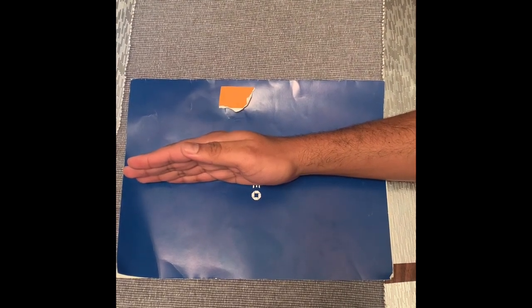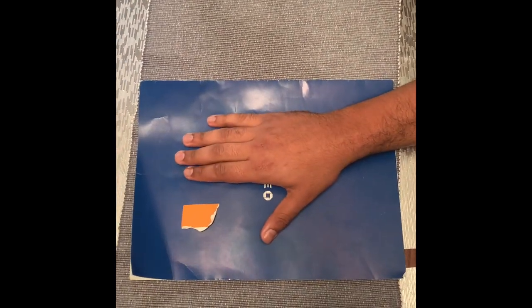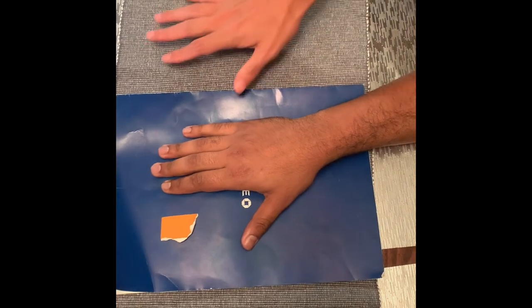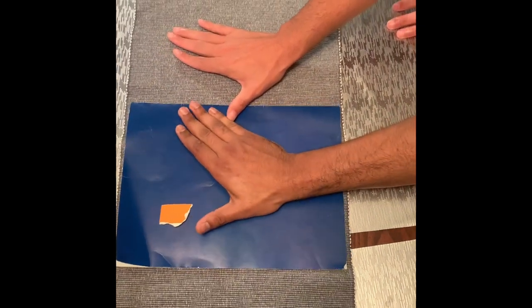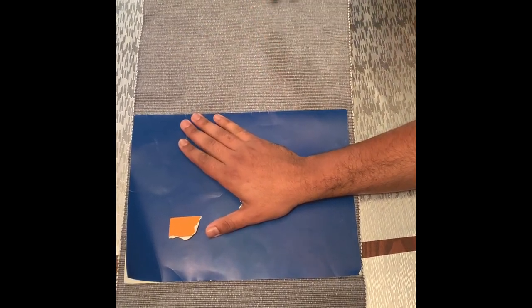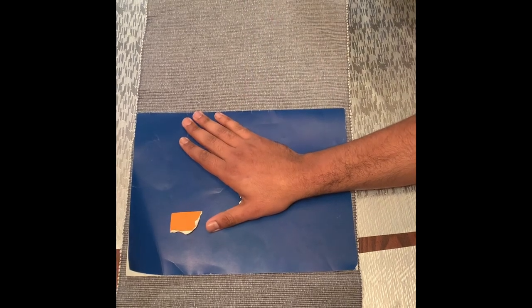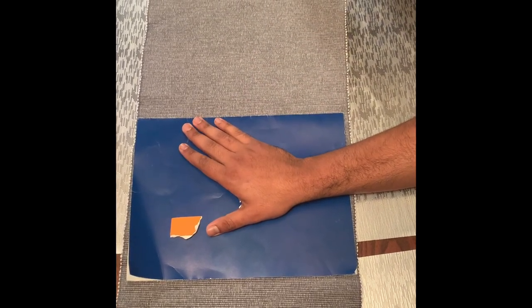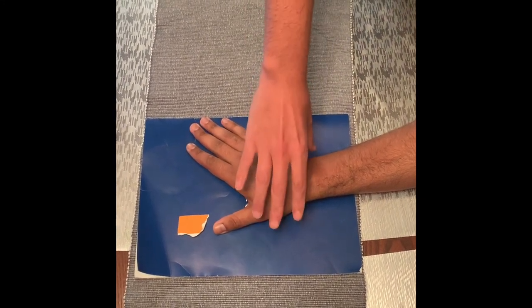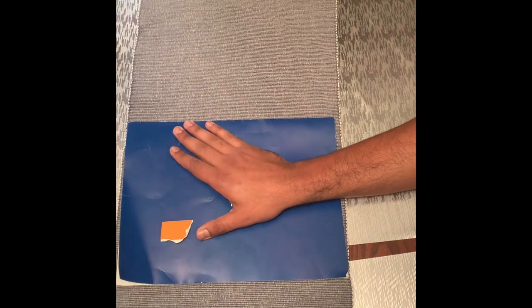For the next three views, the only change is going to be the cassette size, which is going to be 8 by 10. We're going to start with the wrist ulnar flexion. The patient places the hand in ulnar flexion. The central ray location is going to be directed perpendicular to the scaphoid. This procedure may also be done by using a 20-degree tube tilt. The anatomy demonstrated is going to be the scaphoid bone, free of superimposition from the surrounding carpals. Do not move — click — perfect, relax.